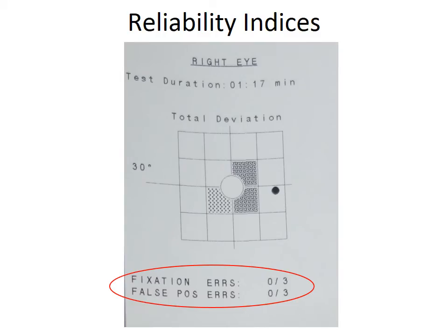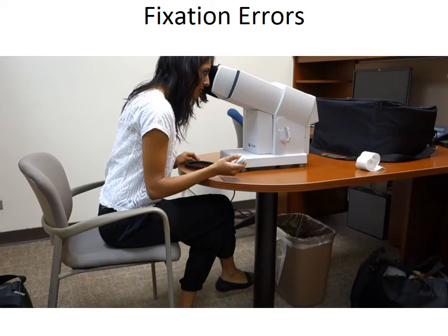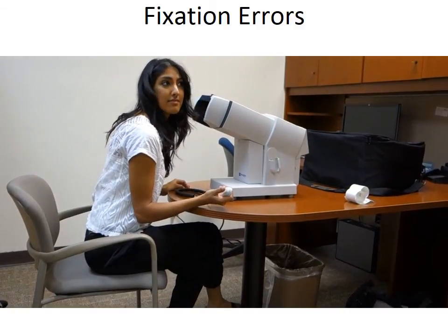The printout will also include information about three reliability indices used to help verify whether the test results are valid. Fixation errors give an indication of whether the patient looked away from the central dot. During testing, small targets are periodically placed in the expected physiological location of the blind spot, and they should not be seen when proper fixation is maintained. If the patient records seeing this target, it is recorded as a fixation error.